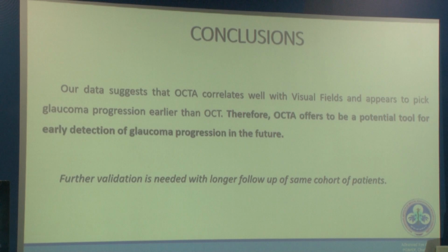So to conclude, our data suggests that OCT angiography correlates well with visual fields and appears to pick up glaucoma progression earlier than OCT. Therefore, OCT angiography offers to be a potential tool for early detection of glaucoma progression in the future. Thank you.